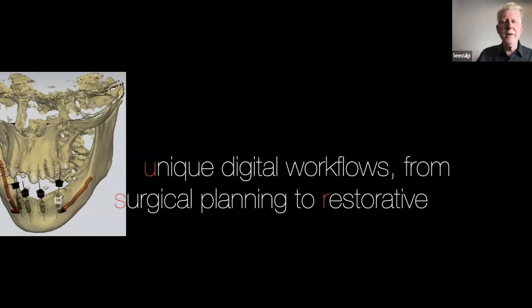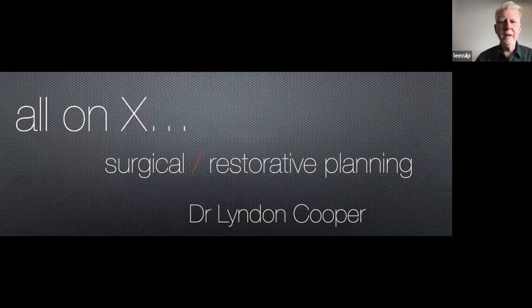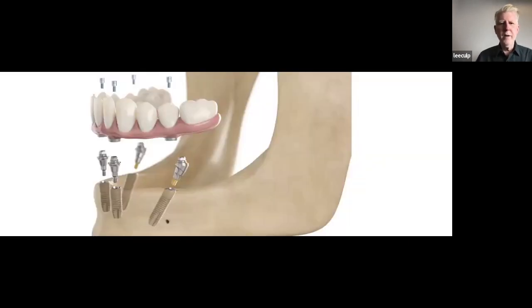It sounds so common, prosthetically driven implant placement. I mean, you'd think everybody would do that. No, they don't. One of the reasons we've kind of morphed into this place is because we really pushed that hard, but we also get some cases in that we did not design, and we're just rescuing. We're just doing prosthetic heroics just to get some teeth in the poor patient's mouth because of implant placement. When we do these cases, I just wanted to show you how powerful dentures are to set up an all-on-X case.